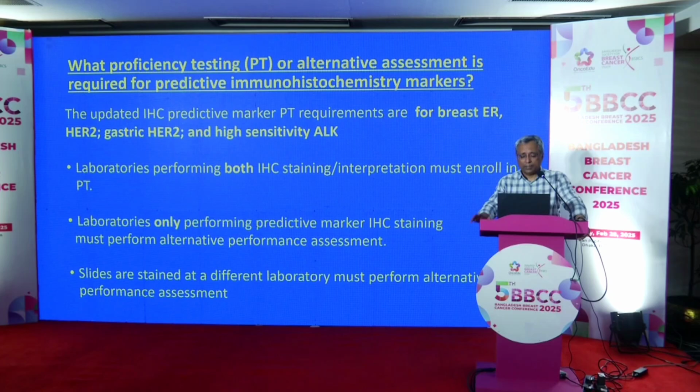So I think it's high time that we look into proficiency testing, whichever way is convenient for us. It could be as simple as just sharing slides. It could be, of course, EQA, if you send it to an overseas body like UK or CAP, it could be expensive. But in the long run, I think it's helpful for the lab. If you do that, I think that will be good. So I think I'll stop here, because I have another part which I think I'll do tomorrow.